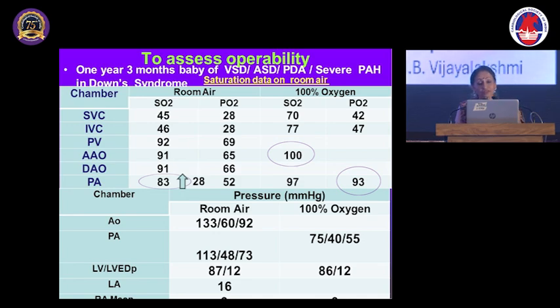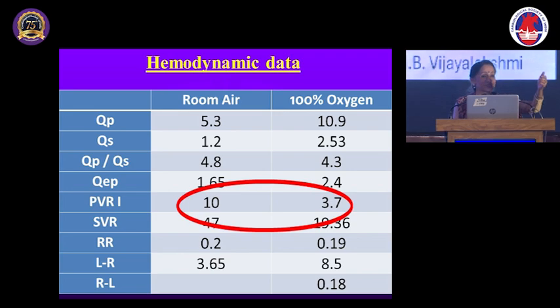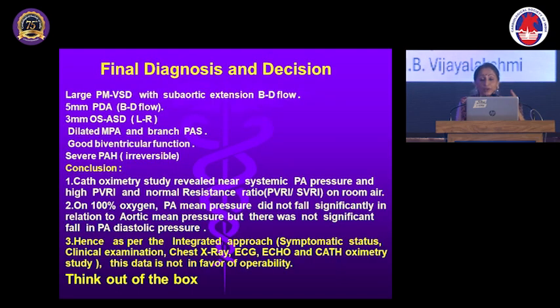In the examination, they'll ask you what the right heart catheters are, and like I asked the previous speaker why the pigtail was not used, they'll ask you how many holes are there and all those things. So you should remember these things, identify the catheters and learn them. Now, indications are very important. Already he has shown you how to analyze the oximetry.